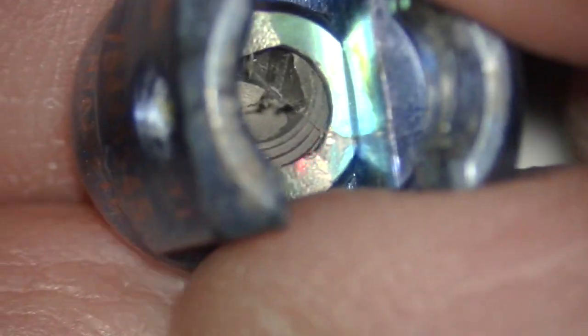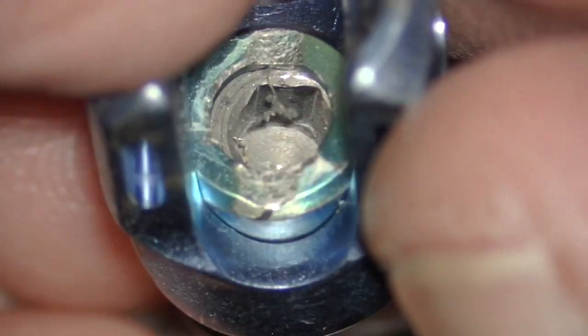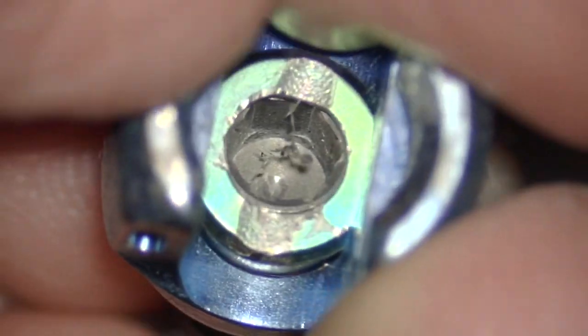You have to be able to see the entire hexagonal female portion of the inner shaft before you take it out. And you can see the variable angled head can block you sometimes, especially with the deep screws.